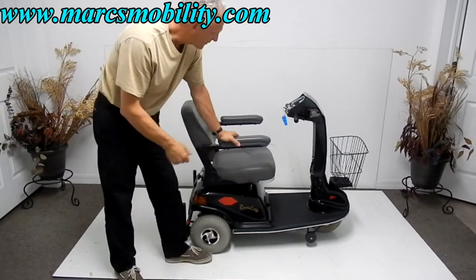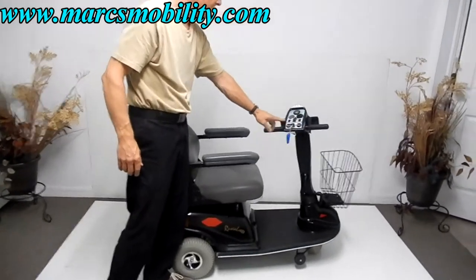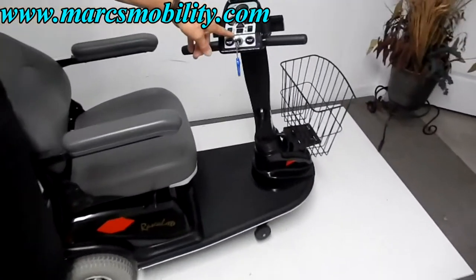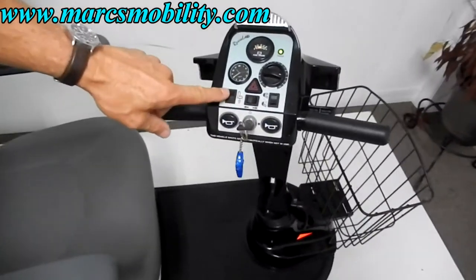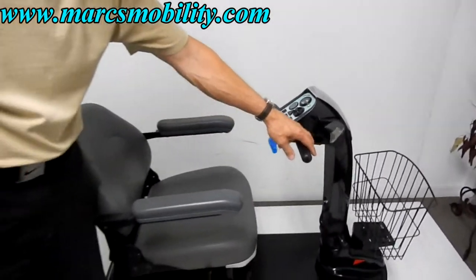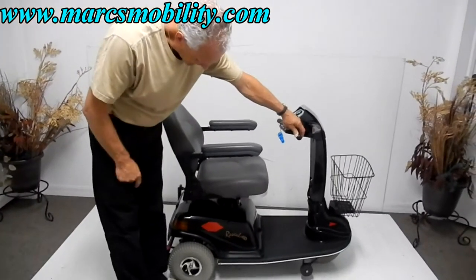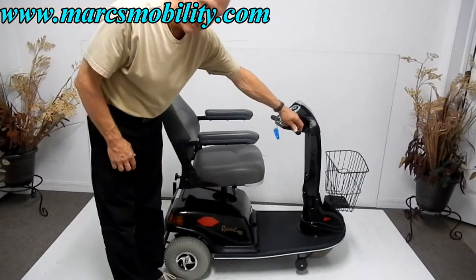To make the seat go up on this scooter, you hit the button on the front of your controller right here. There's a button that shows a picture of a seat lift on it. Flip the button to the seat lift mode, then move your throttle forward, and you can see the seat lift going up on this chair about five or six inches.